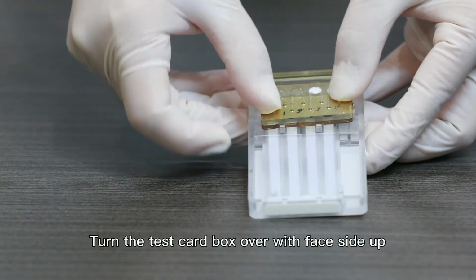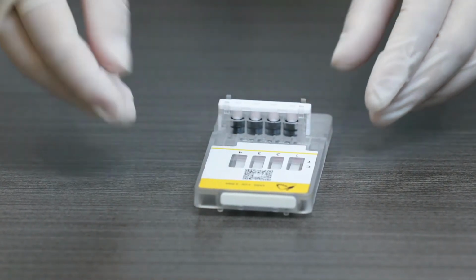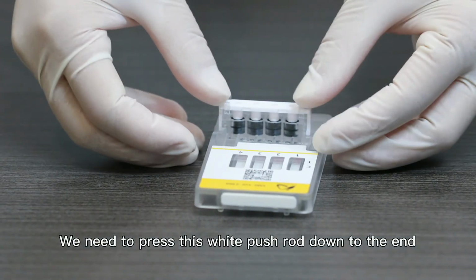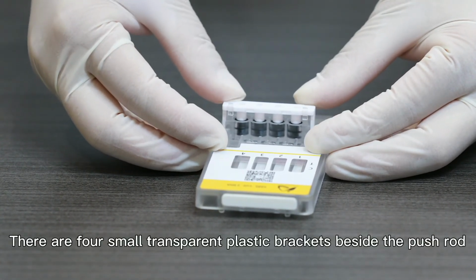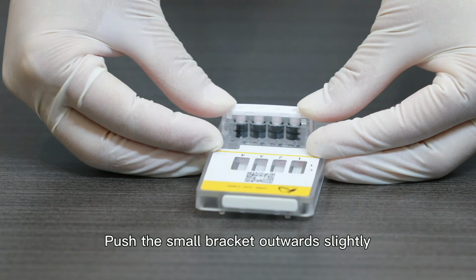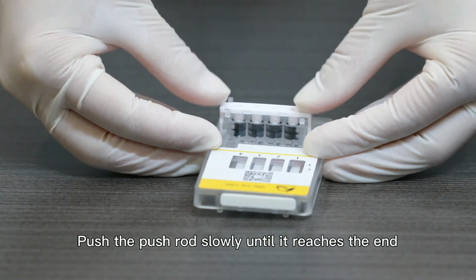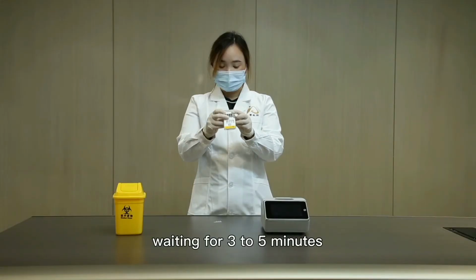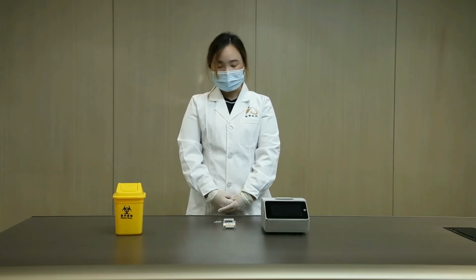Turn the detection card box upside down and place it on the desktop. We need to press this white push rod down to the end. There are 4 small transparent plastic brackets beside the push rod. Push the small bracket outward slightly, and the white push rod can be pressed. Push the push rod slowly until it reaches the end. Next, wait for 3 to 5 minutes. The result will be displayed on the test paper.